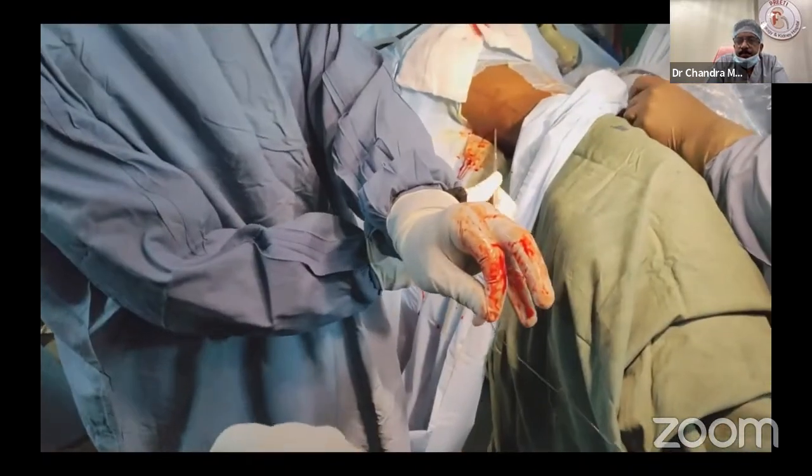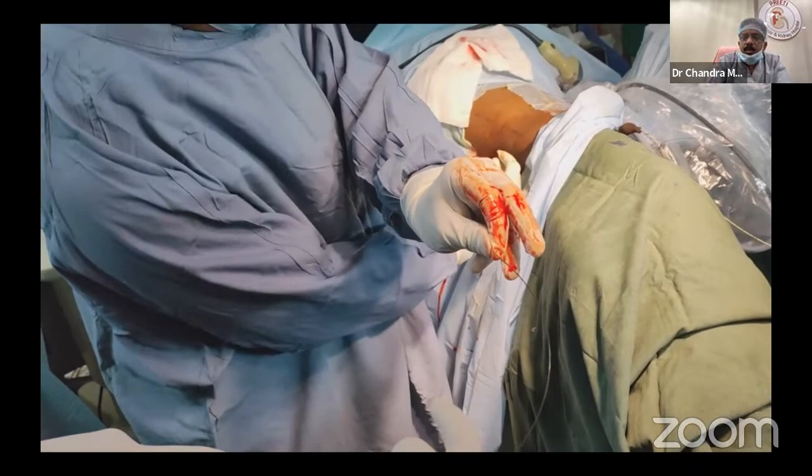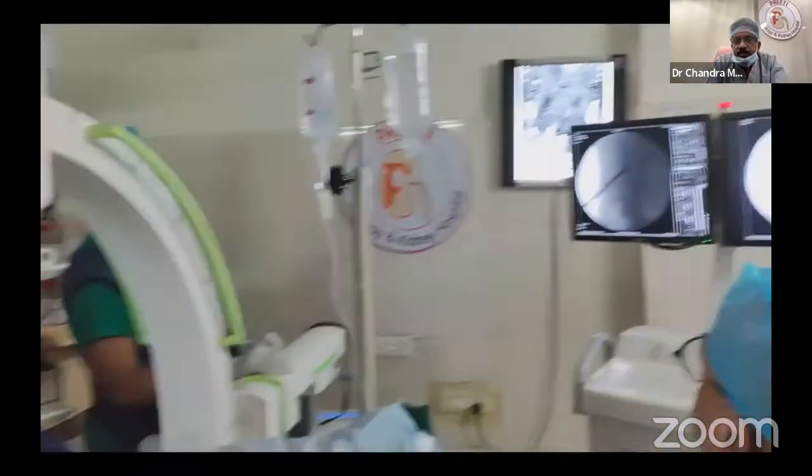This is the brake, whereas this acts as the accelerator. The left hand holding the tip of the Alken rod is the brake, even if you are doing single step. The right hand is the accelerator. The brake should be stronger than the accelerator, so that inadvertently you don't go beyond the calyceal anatomy. Rotation movement. You should know the limitation.